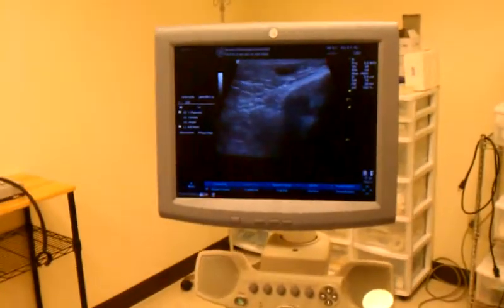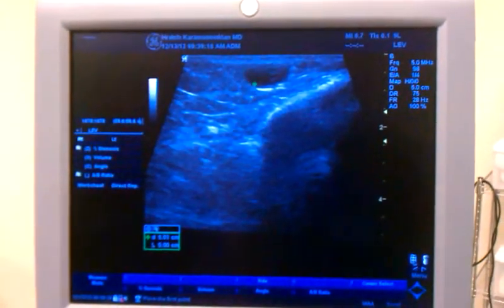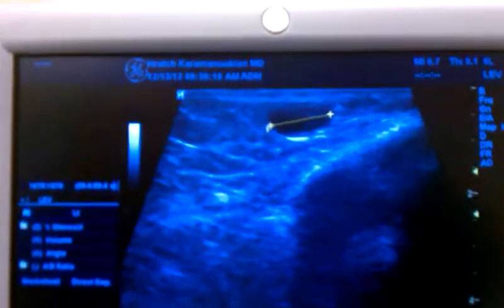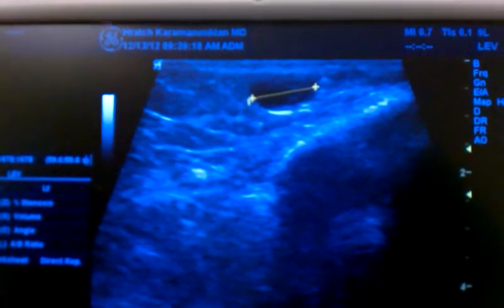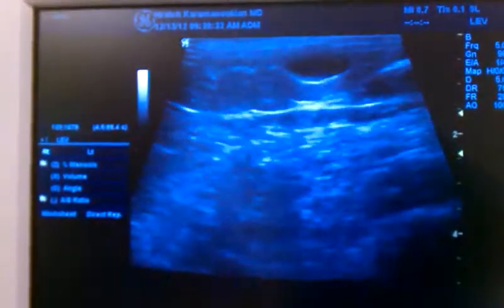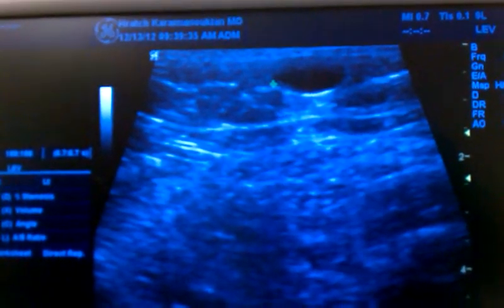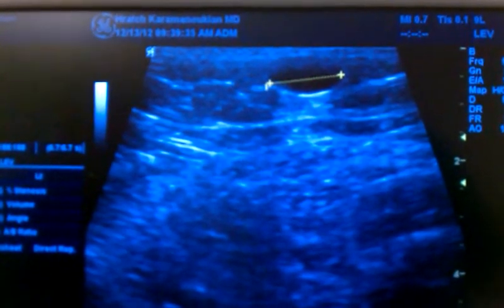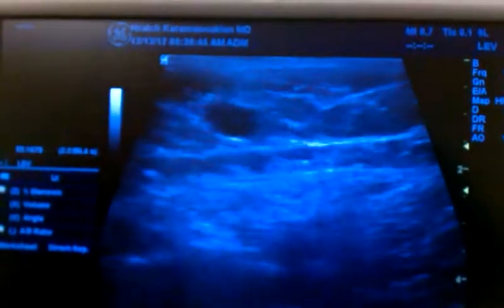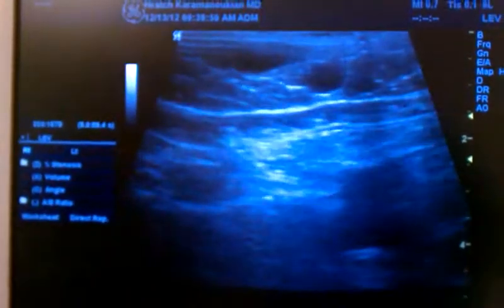This is below the knee. You can see it's quite big, and when I get the measurements, these varicose branches of the great saphenous vein exceed 1.19 centimeters. And then up here in the thigh, you can see many varicose branches. This one here in the middle of the thigh is 1.3 centimeters. It's recorded. You can see much more branching here. All these are branches of the great saphenous vein anterolateral branch.